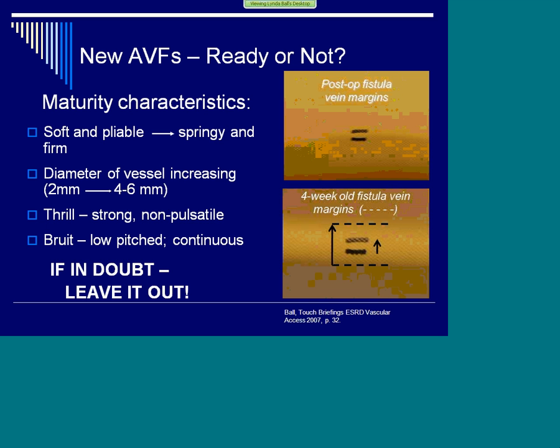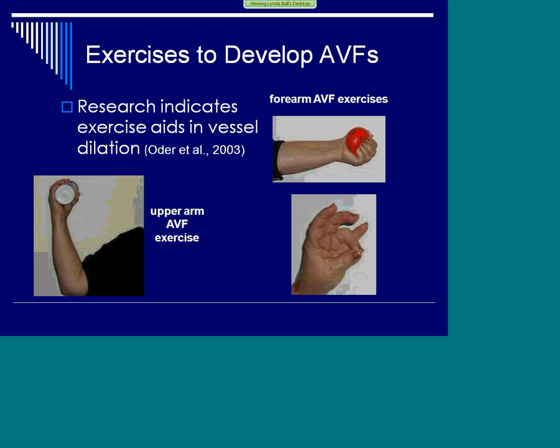So we're trying to teach pathologists and surgeons that if we say it's not ready to cannulate, and we've got the expert cannulators there, then they need to listen to us, because we have the expertise when it comes to putting those needles in and putting it against a blood pump. Putting a needle in is one thing, but putting a needle in and then trying to suck blood out and push blood back through, that's a totally different thing when we're using pressures. And those are high pressures considering the system that we're in.